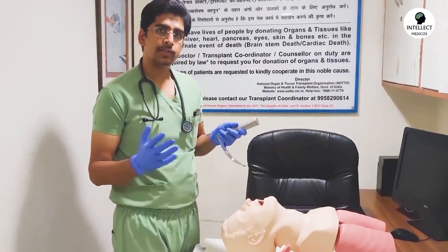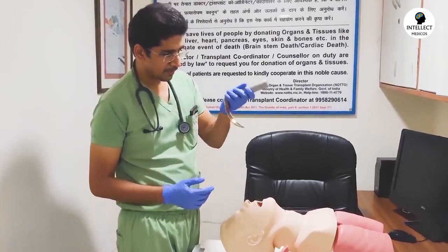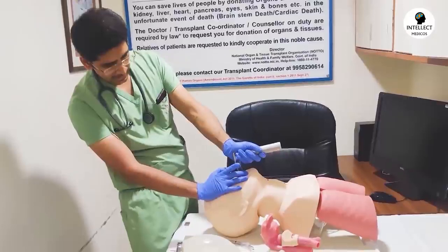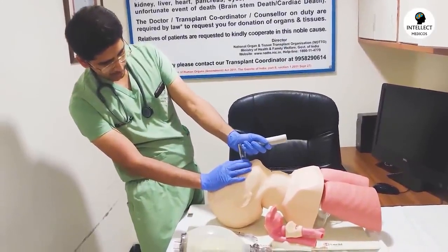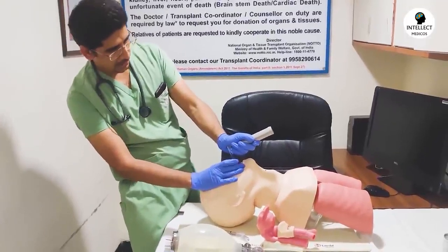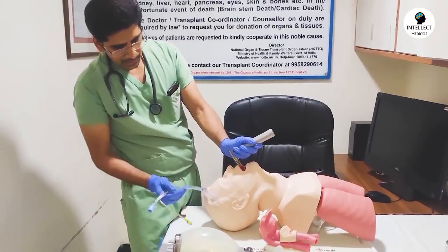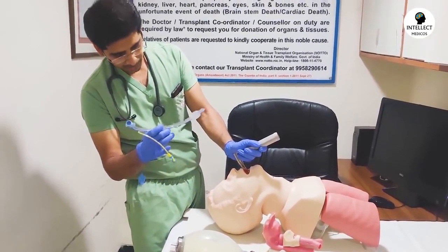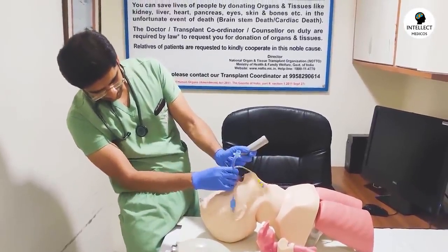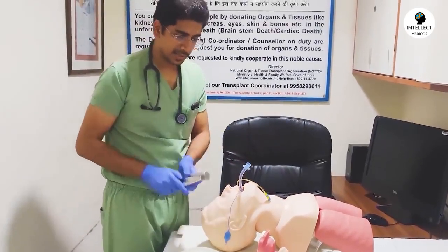So now I'll show you the zoomed out version, how your position should be while intubating. So laryngoscope in one hand, you just open it, go gradually inside, and I can see the epiglottis right now. I will lift it up. Yeah. So this is my hand position like this. And with the other hand holding the endotracheal tube after lubricating in this manner, I'll go inside, and yeah, I can see, and I have inserted the endotracheal tube till that black mark which I discussed.